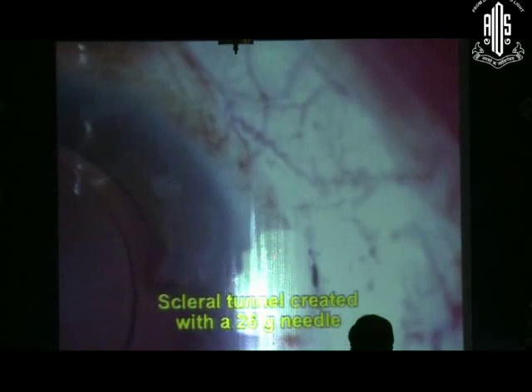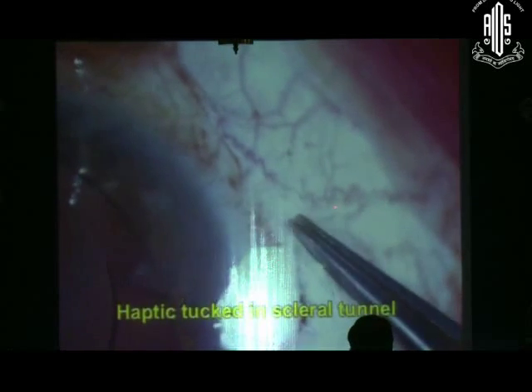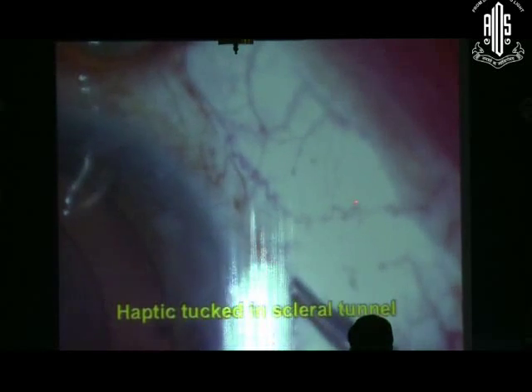As you can see, this is the vitrectomy that is being done. The tunnel in the sclera has to be made, and you can see this is a tunnel that is being made in the sclera, and the haptic needs to go into this tunnel. Until the haptic goes into the tunnel, the lens will fall. So you can modulate the amount of haptic that is tucked on the right side and the left side, and what that will do is help you centralize the lens.